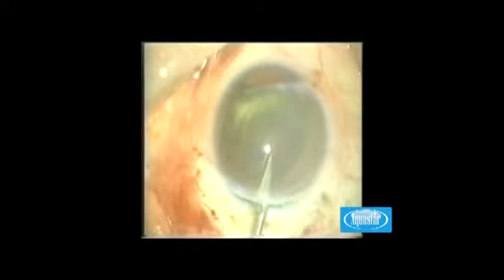Here's a condition after a perforating injury which occurred many years earlier with iris and lens involvement in the form of a zonulolysis in the lower circumference. First, a capsular tension ring is injected to stabilize the capsular bag situation after capsulorhexis. Then the nucleus of the lens is mechanically extracted under consideration of its hardness and the zonule apparatus. Specific capsulotomies are performed for this purpose in the upper circumference of the capsule at 10:30 and 1 o'clock.